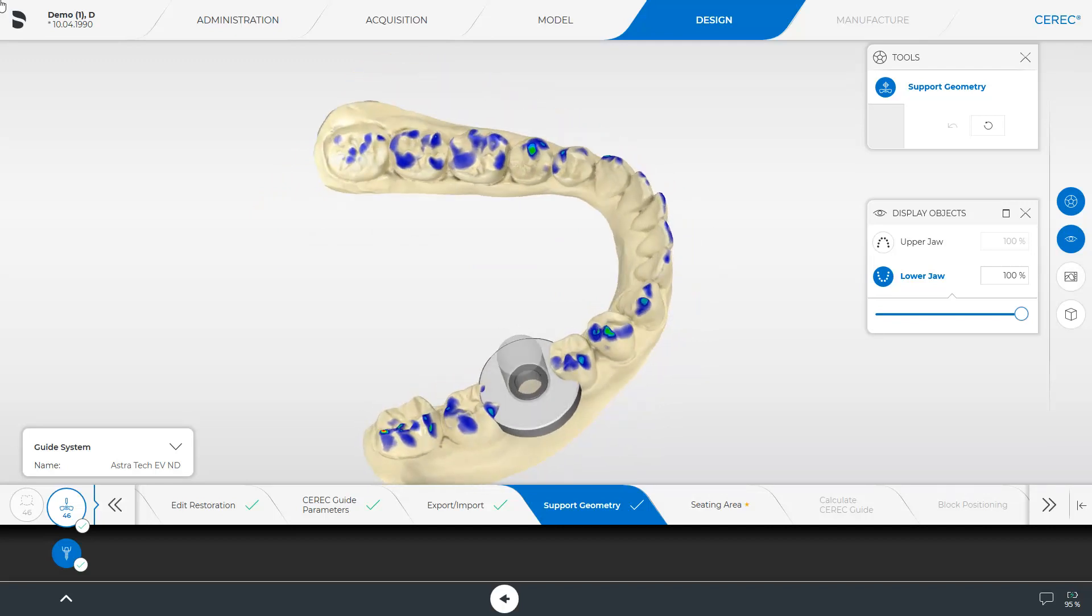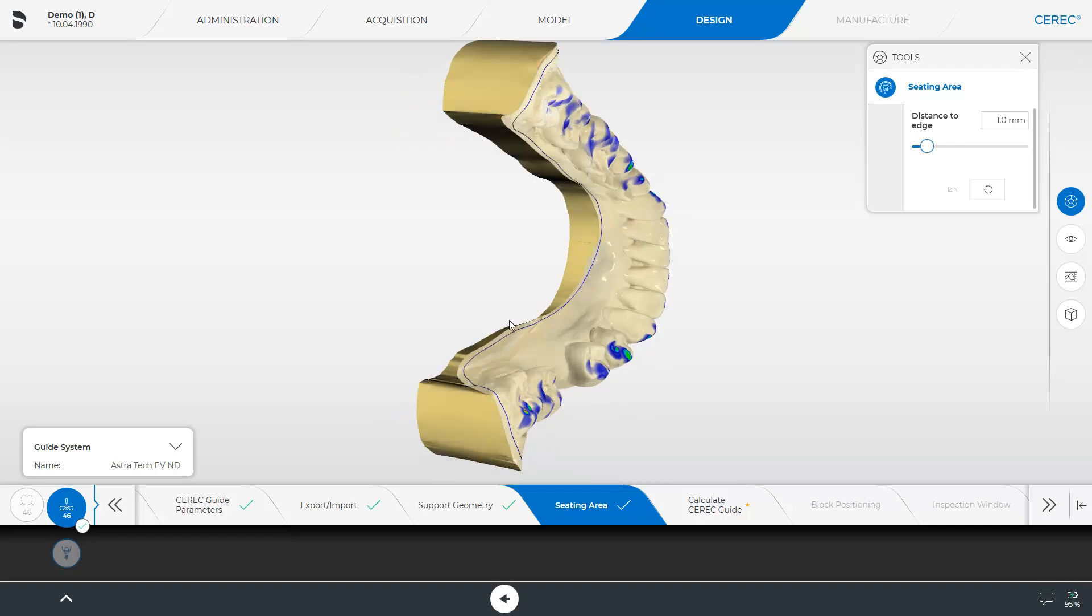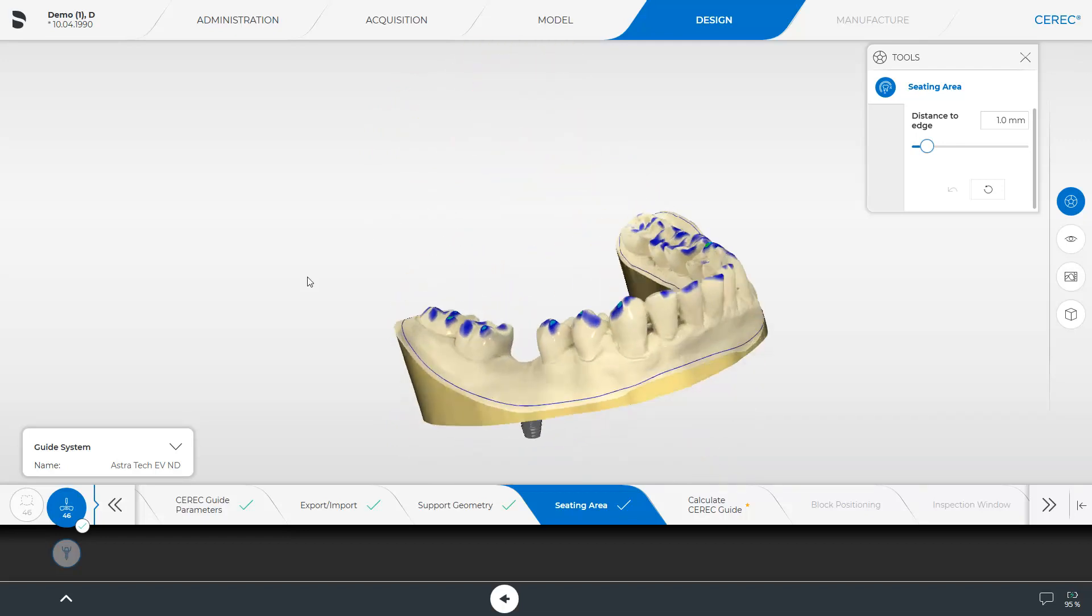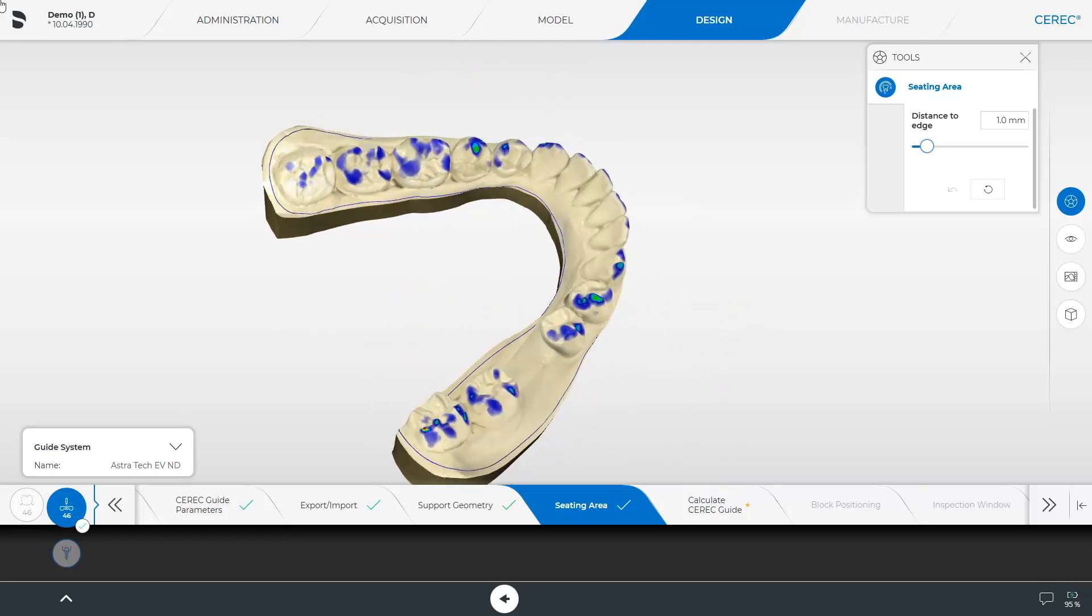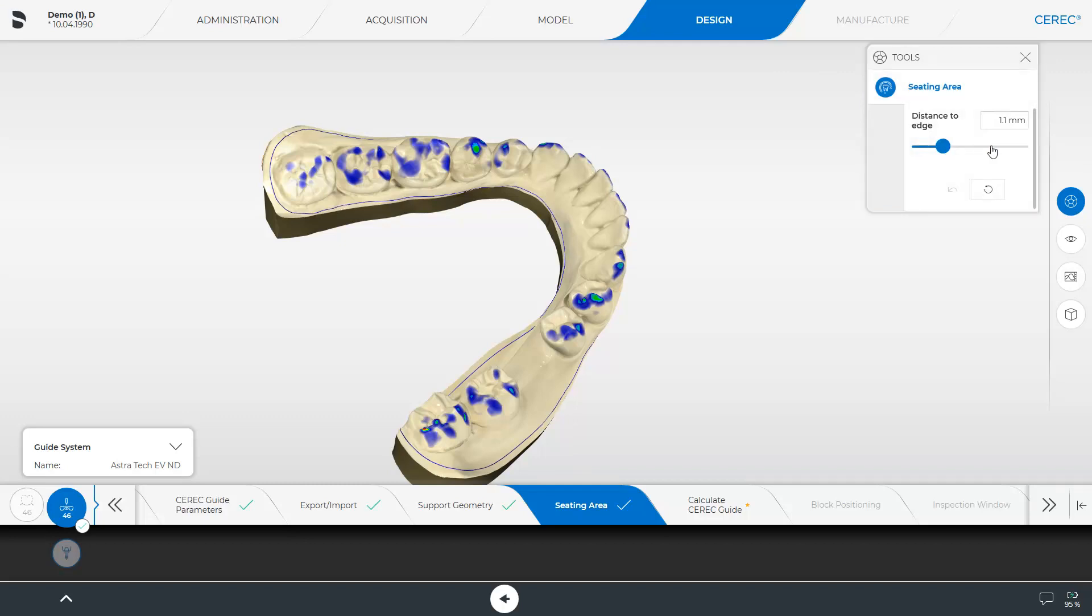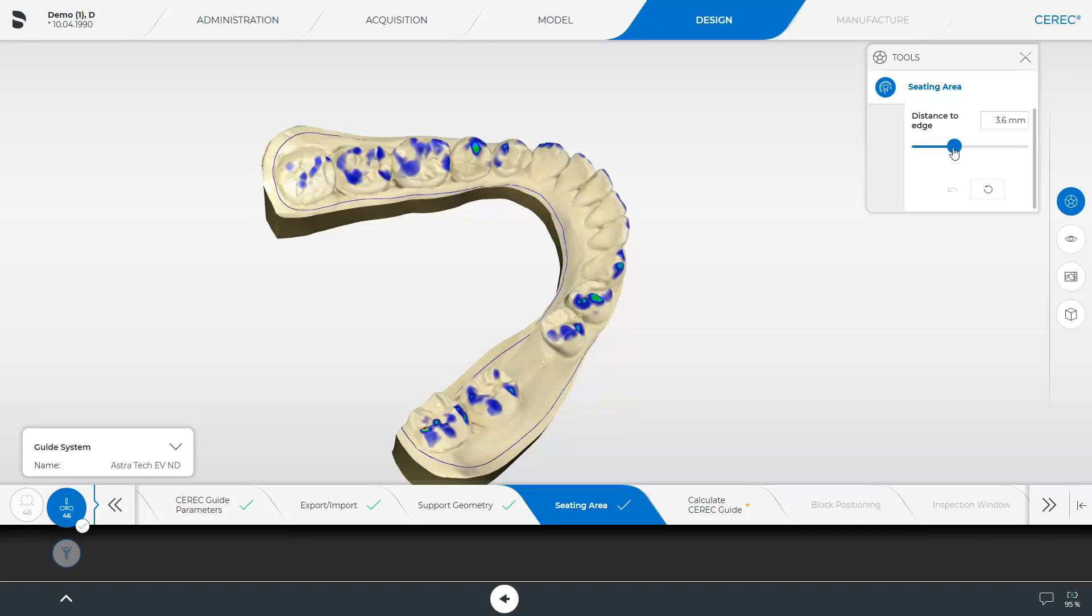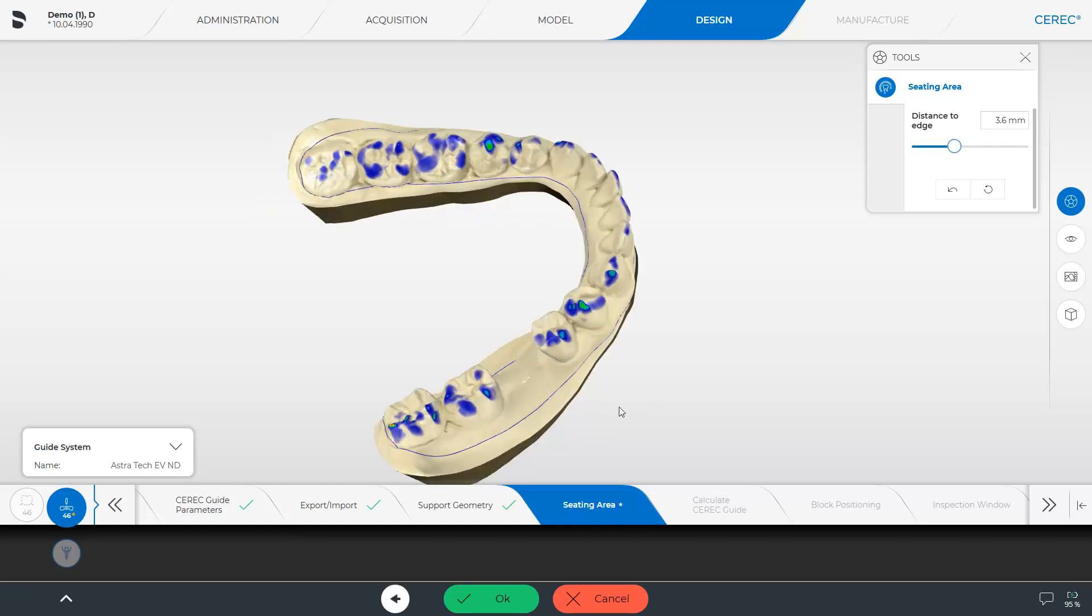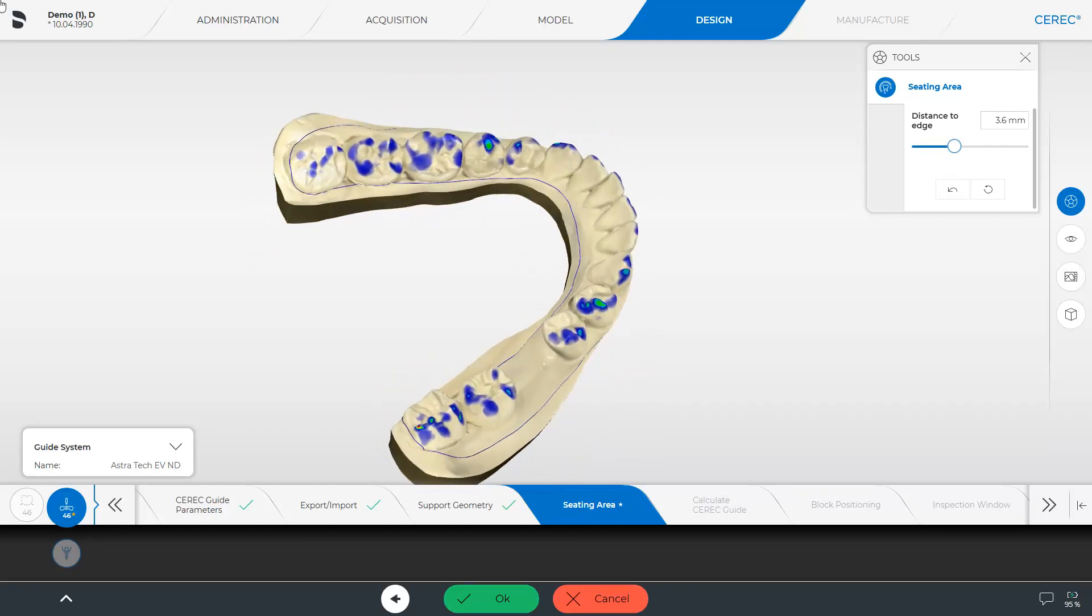We proceed with the next mandatory step, seating area. The CEREC software automatically calculates an initial proposal for the seating area of the guide. For modifications, there are two tools available. In the Tools window, you will find a slider, which you can use to increase or decrease the distance to the edge. Then you can confirm with OK or Cancel.